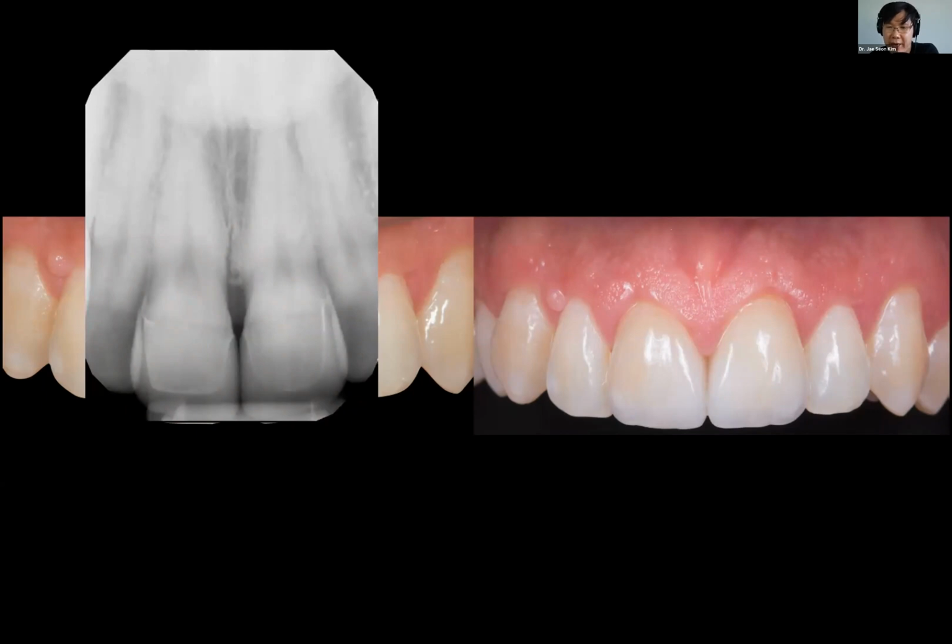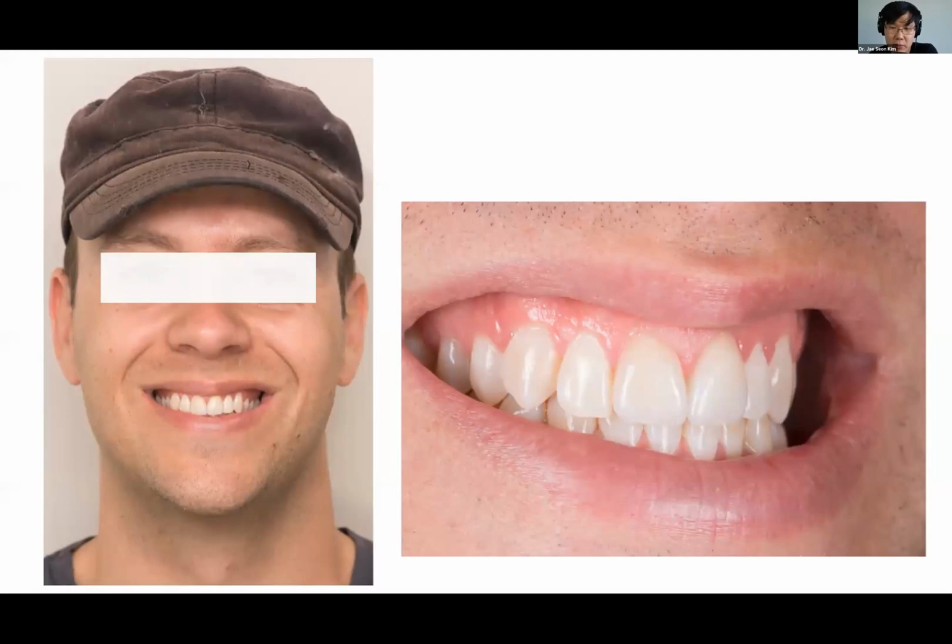These are actually called amber press. It's a lithium disilicate restoration from Korea, and Ben and I have been using this for all of our lithium disilicate restorations. We've been having pretty good success with it, and Ben likes the way the colors and the translucencies turn out, and the powders that he uses also integrate pretty well with these. So we've been using this for a while.